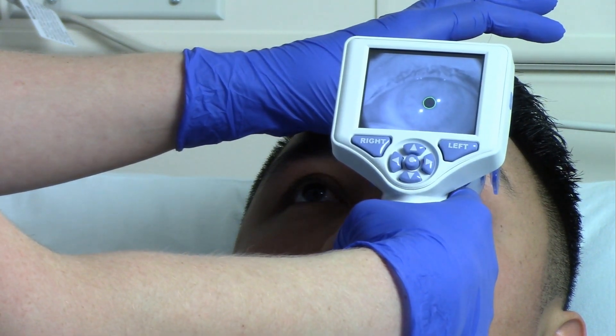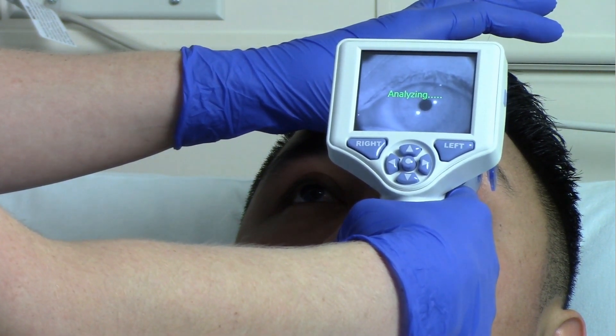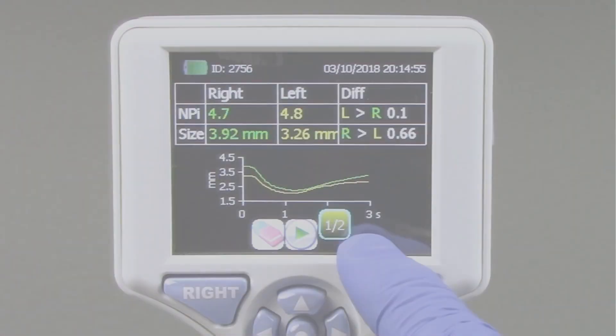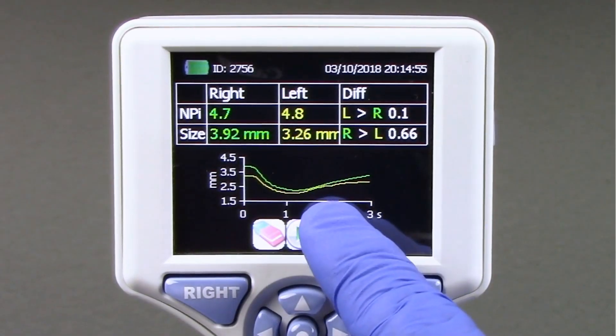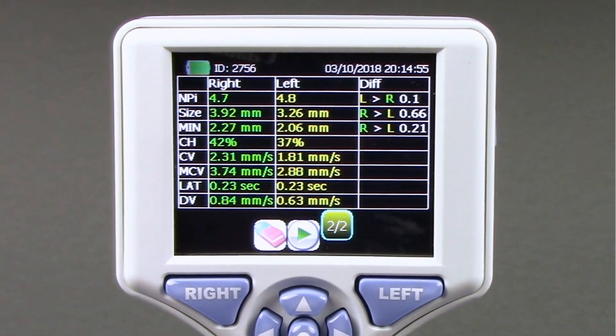When the bilateral pupil exam is complete, the NPI 200 measurement results will be displayed in yellow for the left eye and in green for the right eye. Using the touch screen or keypad, select page 1-2 or 2-2 to display the results of the pupil measurement parameters and pupillary light reflex waveform.